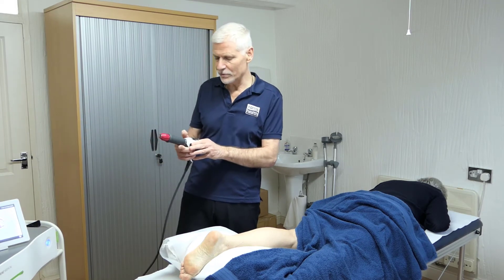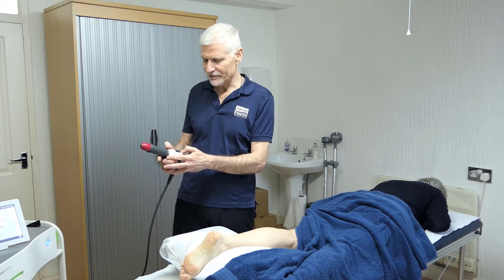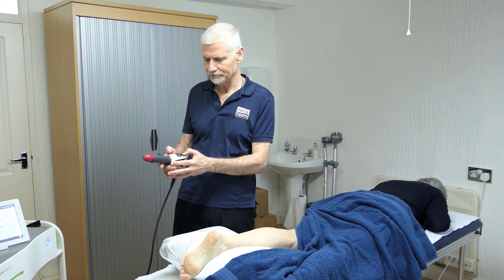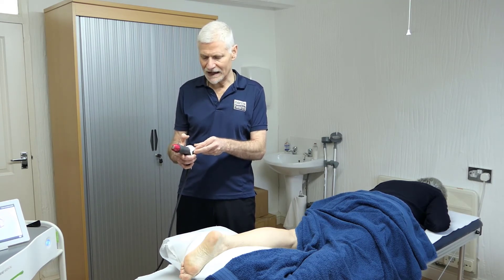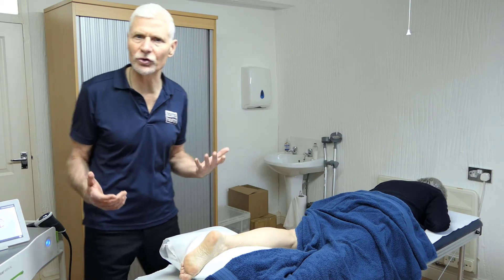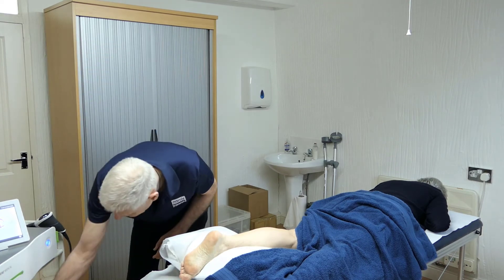Let's listen to the machine itself when I turn it on. At a fairly low frequency, you can hear it a little bit like a drum. At a higher frequency, it starts to speed up a little. To start with, we use a fairly high frequency with a low pressure, and that has a pain-relieving effect — a numbing effect — and that is a little bit like the warm-up to the treatment.